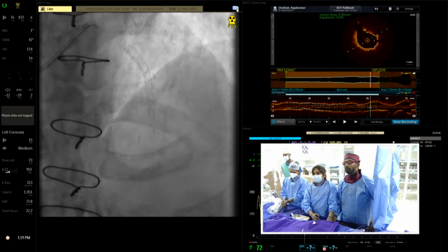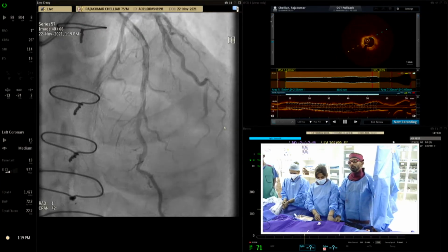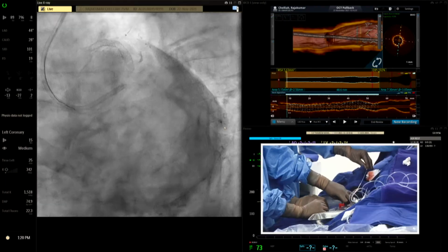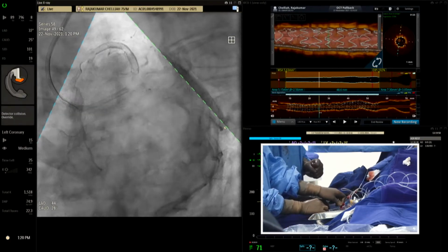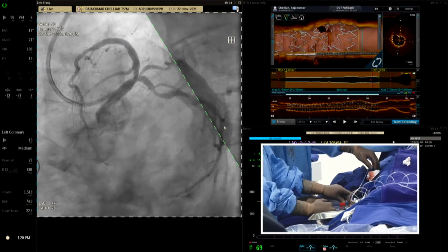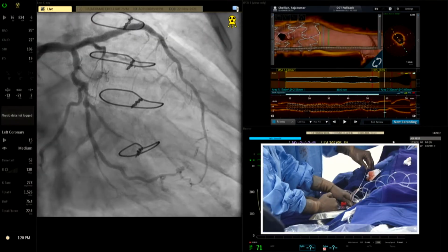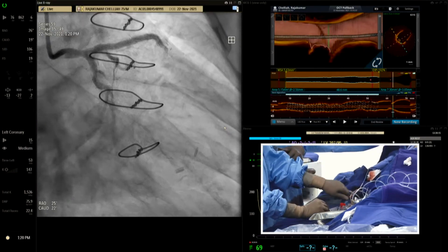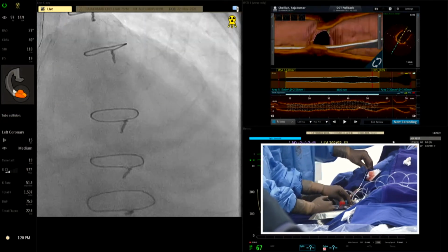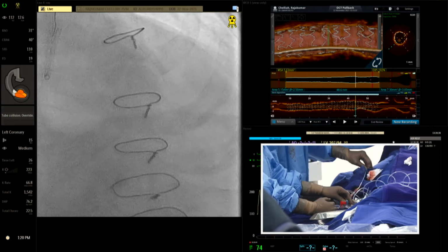Ready? Okay. Wait for a couple of minutes. Now inject. Yeah, all is good. And one more caudal, I think, isn't it? That's RA caudal or something. What is the LAD ostium size? No, that's good. I'll show you. 6 or 7. Ready? Yes, sir. And last RA cranial. Yeah, it won't come. Okay, don't worry. Just turn your head. Ready? Last picture.